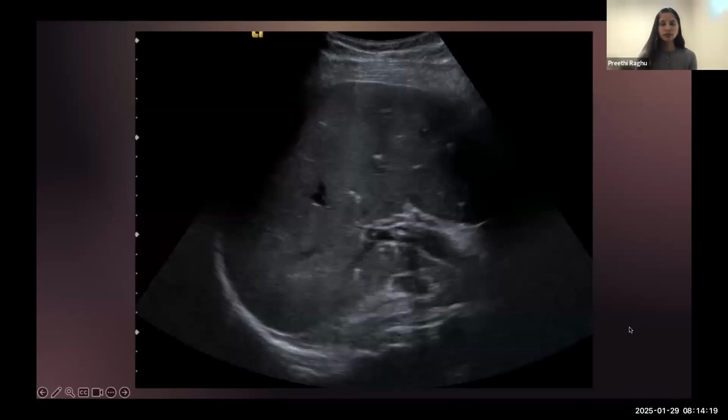And just to show how challenging these can be, this is another patient where we saw those little hyperechoic foci within the liver. So at first glance, this kind of looks like our previous case and raises the question of things like pneumobilia, but these do not have that dirty shadowing that I mentioned deep to it. They just look like these isolated little bright dots within the liver. And notice that they're all sort of evenly scattered throughout the liver and very similar in size to each other.